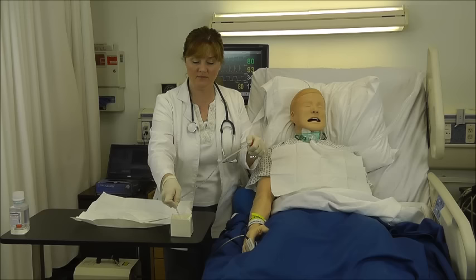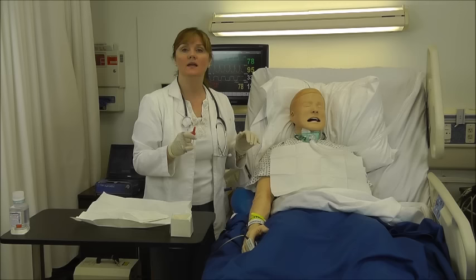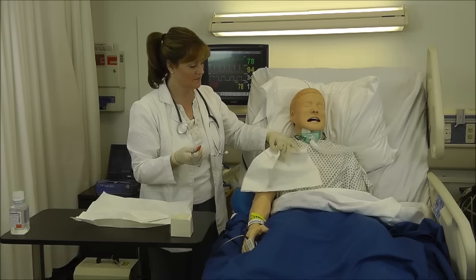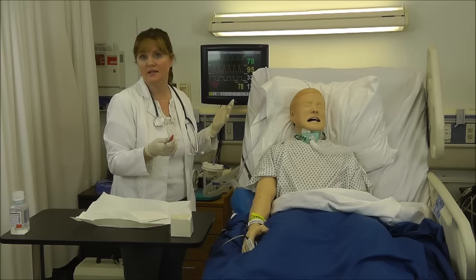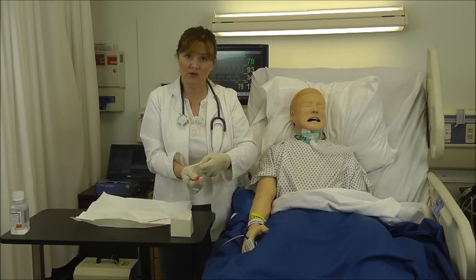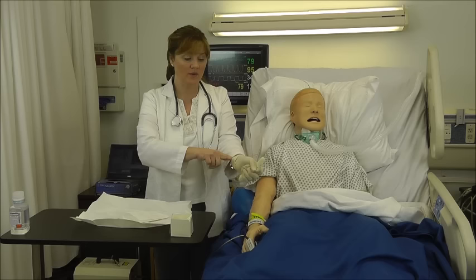Now I'll wrap this around my hand and disconnect. While I still have my gloves on, I'll remove the drape that's got some secretions on it and discard. And I'll turn off the suction machine. If you have wall suction, you can leave it on until the end. That's fine. I'm going to take my gloves off properly by grabbing the outer portion of the glove and wrapping up the catheter within it, balling that glove up in my hand, going under the second glove, and removing, and discard.